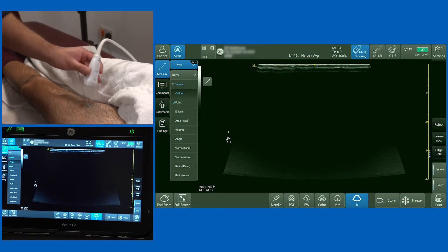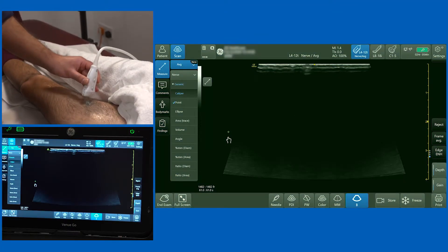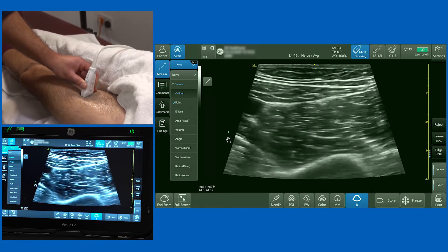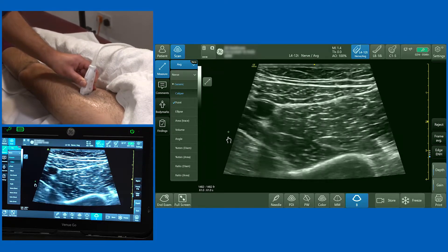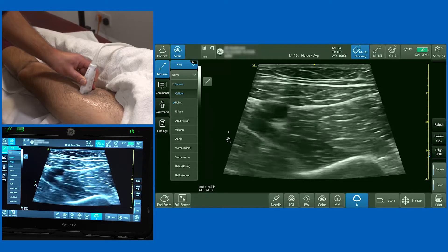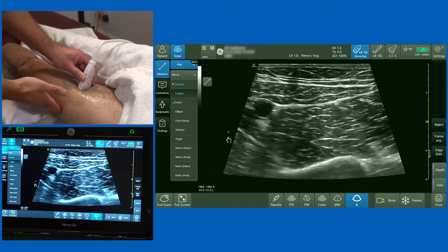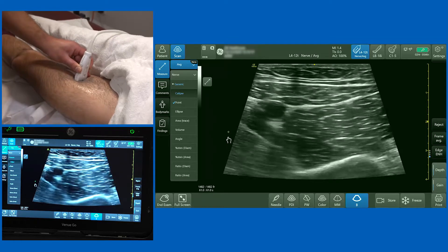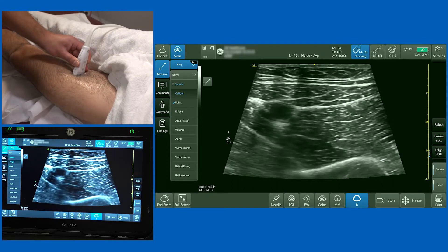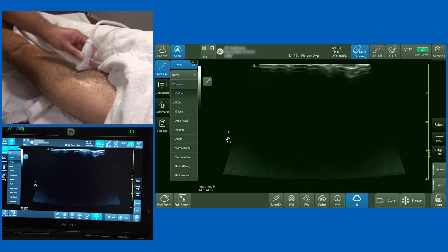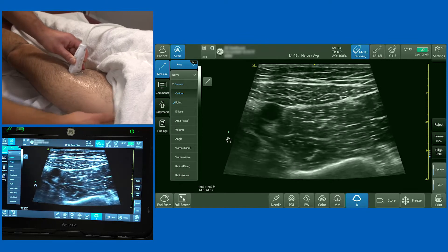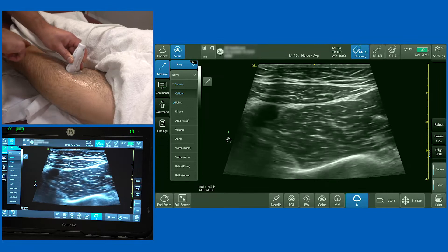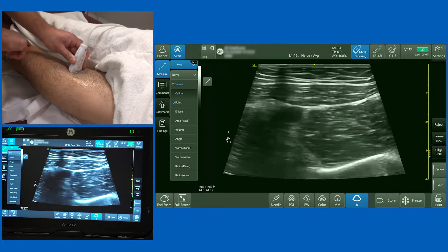We're now going to demonstrate the adductor canal block, which is a block that has become popular recently as a motor-sparing knee block for patients having total knee arthroplasty. The hip is slightly abducted and I'm placing a high-frequency linear probe utilising the virtual convex function in the mid aspect of the thigh. To orientate yourself, you've got the anterior superior iliac spine over here and the medial femoral condyle lower down here.